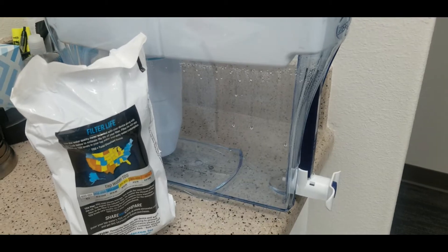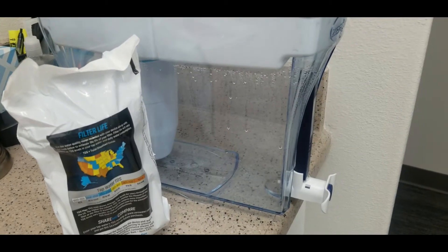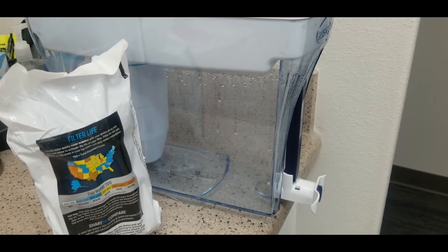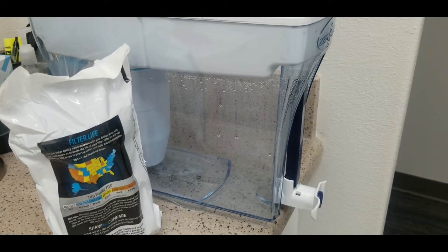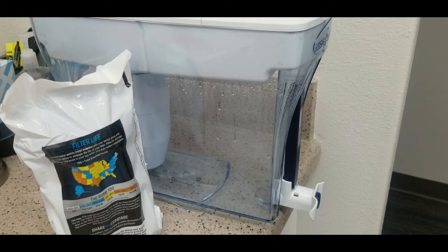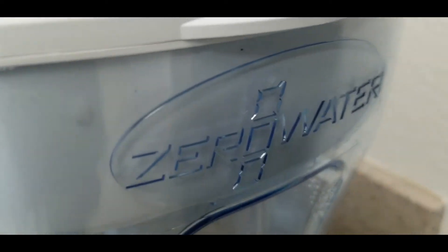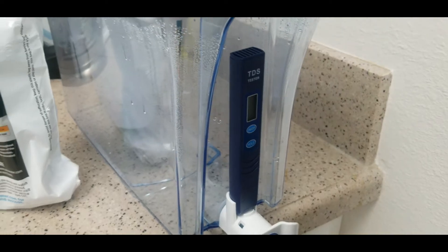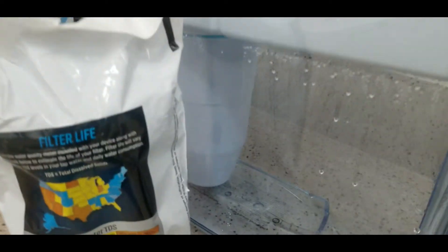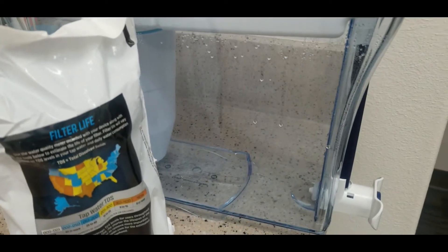The reason I went ahead and got this is because in our city we had a shortage of distilled water — you couldn't find it anywhere. The entire region was having a shortage, so we bought this zero water filter as a backup so we could make water equivalent to distilled water for use in the equipment.